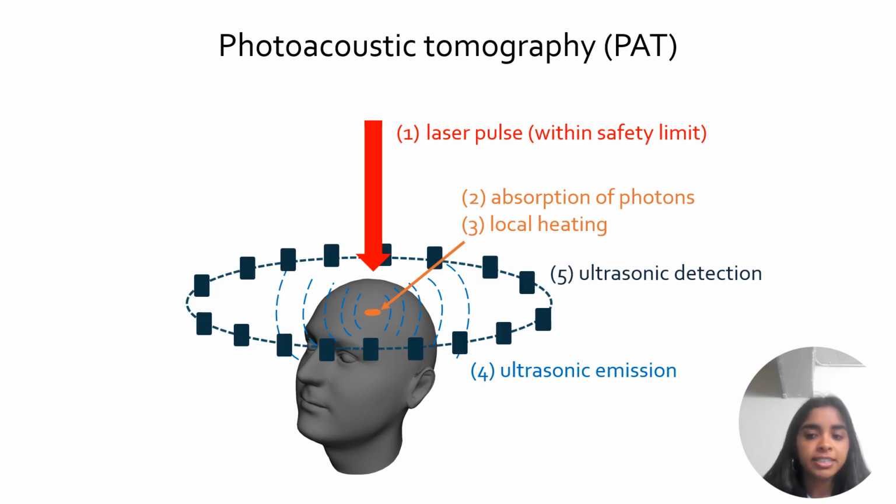The waves are detected by an array of transducers surrounding the object, and the resulting measurements can be used to reconstruct an image of the object's interior.